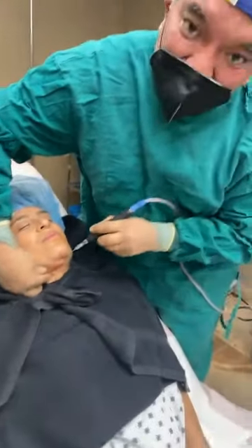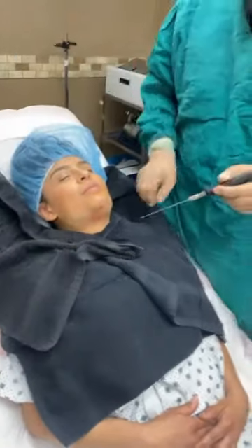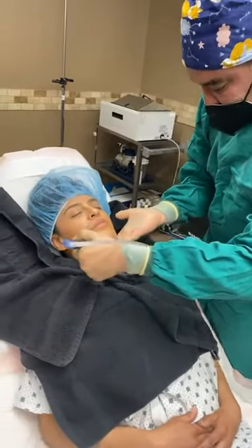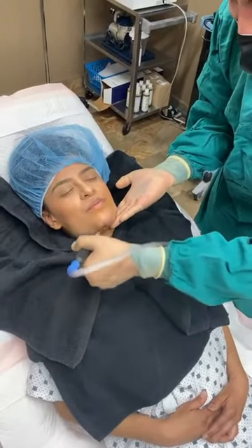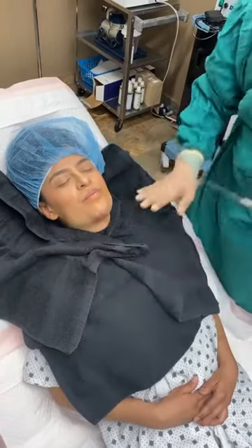And I'm practically done. The next thing I'm going to do is just close the site with a stitch. And when the patient starts to get uncomfortable, that's probably where you know you've done everything you can. Because this numbing solution will last more than an hour, but if she's starting to get, or he's starting to get uncomfortable with what you're doing, you probably have done everything that you can. All right, we're going to stop there.